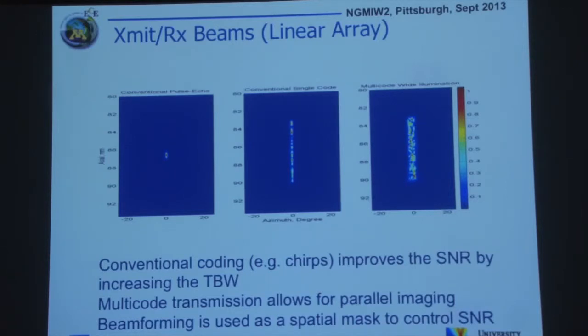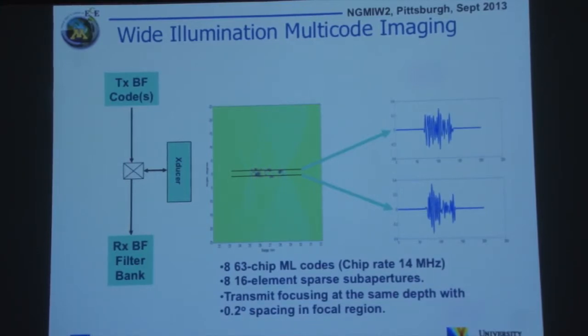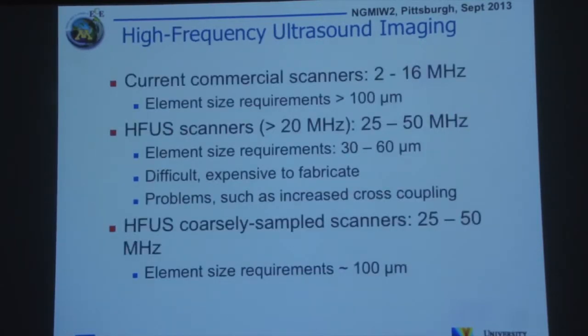What we did in the 90s was synthesize the best possible codes on the array and let them propagate and see how we can compress this back in time to get something like this, axially and laterally, so that we can recover the basic characteristics of the system. But the idea is that a wavefront like this can have different waveforms in different directions, and these can be decorrelated and processed in parallel. A single beamformer output can give you multiple image lines. So that's our approach to this problem, and we're modifying it. I'll show some results later today.